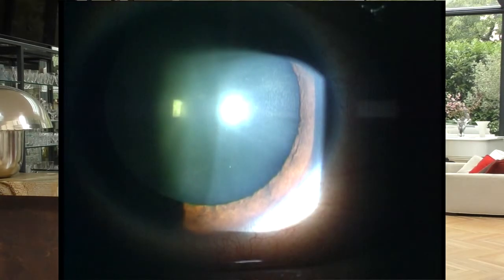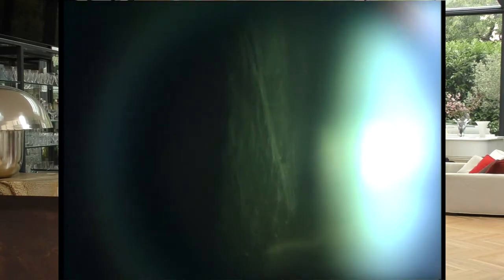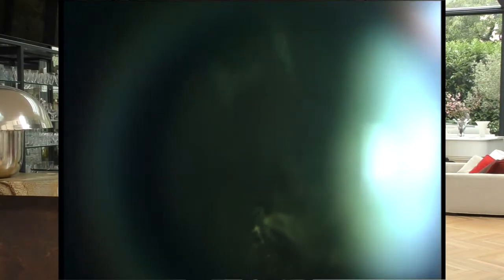The first thing you will notice is the quality of the pupil dilatation. A good dilatation is a very good prognosis. You will take this opportunity to defocus a little bit in the vitreous, because when the PVD is complete, you can see the posterior hyaloid and the vitreous moving during the movements of the eye.